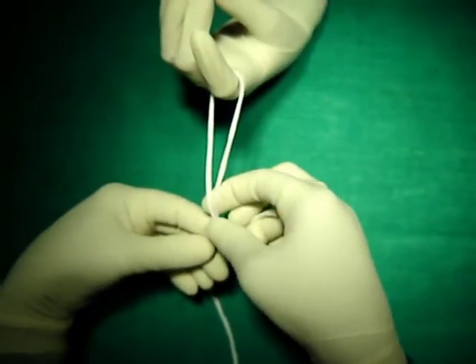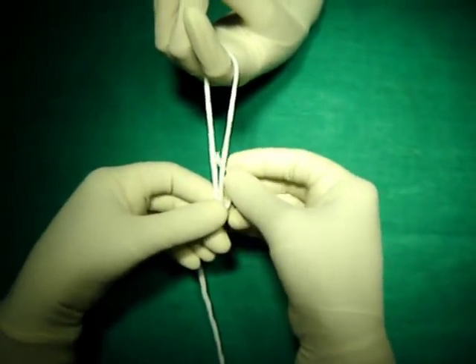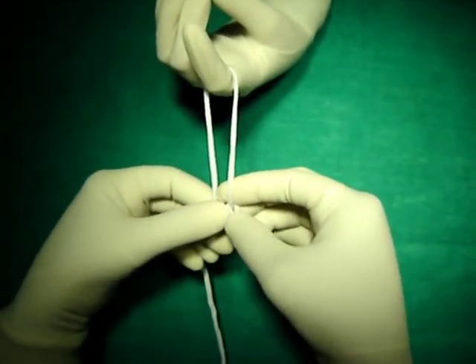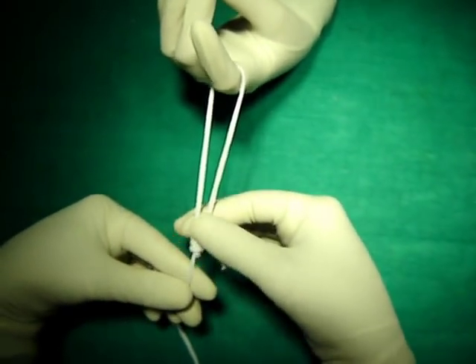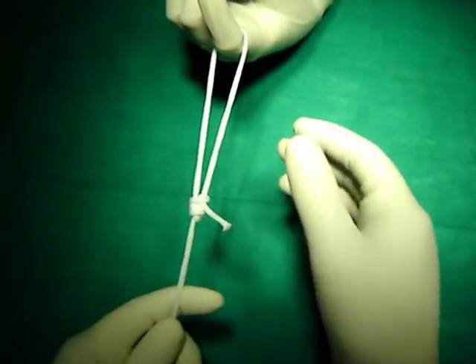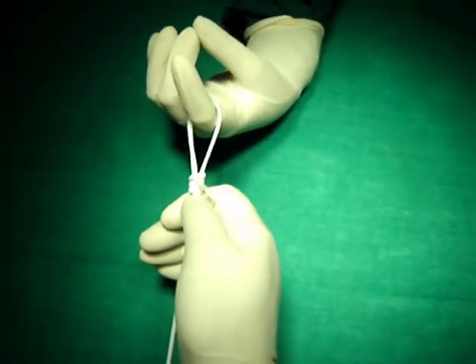All the winds should be stacked properly. One half knot should be taken around one side of the loop. The knot should be configured so that it is stacked properly, and then with the help of a knot pusher, it should be slid towards the target.